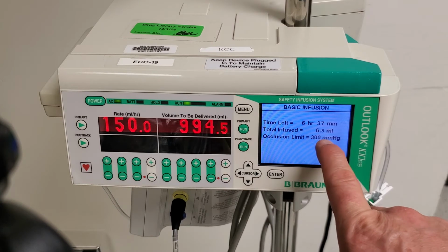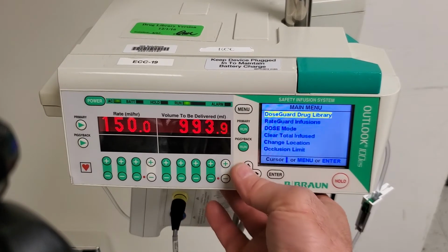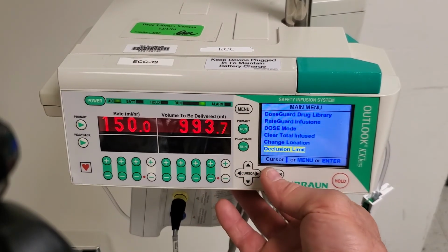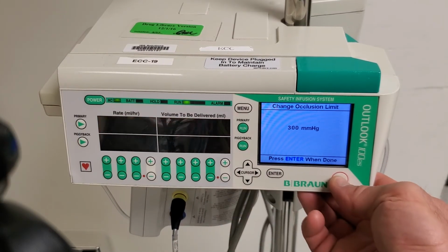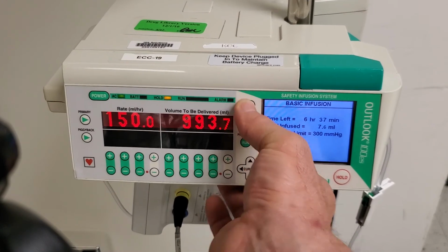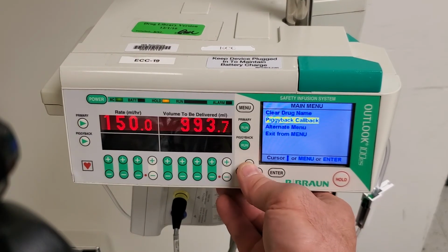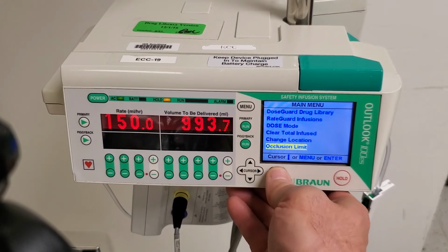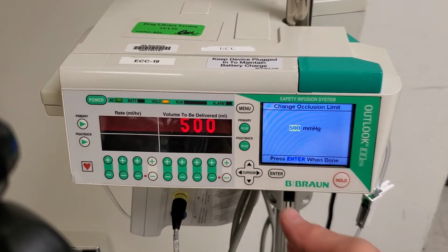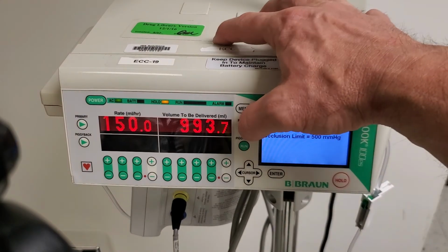So notice that the occlusion limit is set to 300 millimeters of mercury. There are cases with smaller catheters where you might have to increase that limit. The way to do that is to go into the menu, choose occlusion limit, and then you can change it on the screen here. But it won't allow you to change it until you've stopped the pump. So we can change it up to 500. Now our occlusion limit is 500.